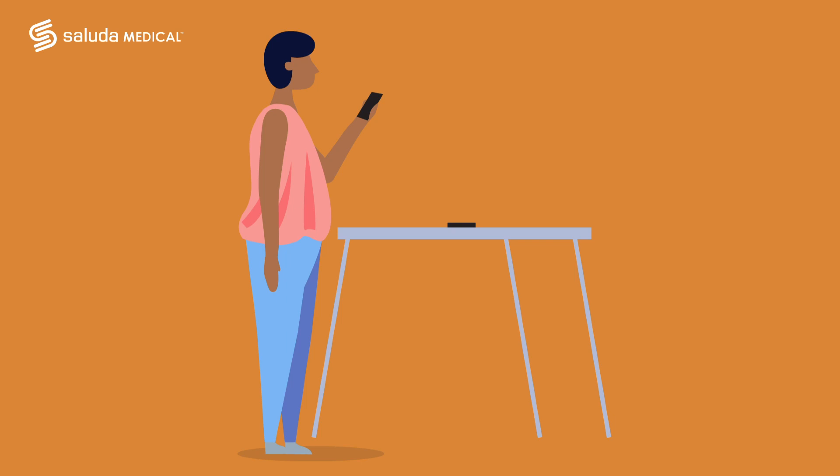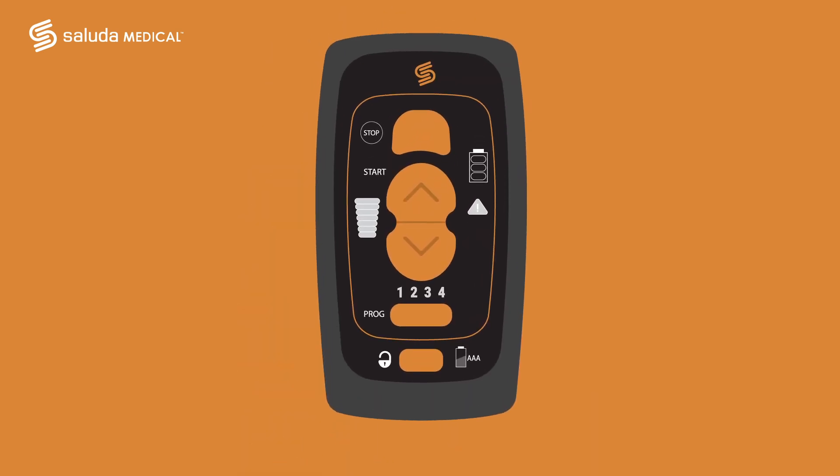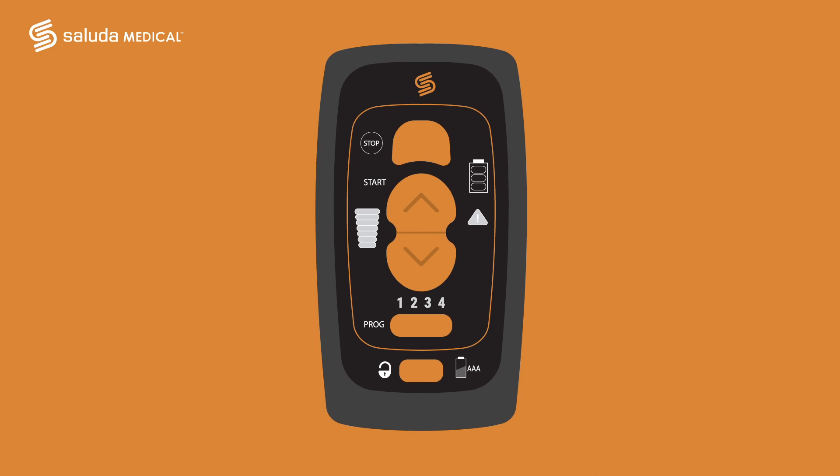As we walk through the use of the remote, you will hear one beep every time you press any of the buttons. Before we begin to adjust your stimulation, you must first turn on your remote. Looking at the bottom, you will see the on/off button. Press the button for approximately two seconds and wait for the remote to connect to your stimulator.